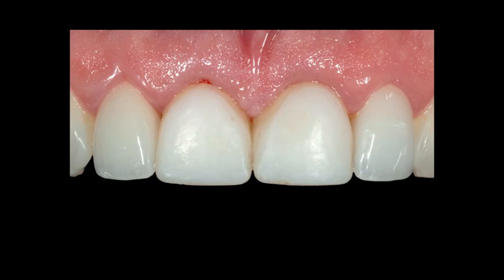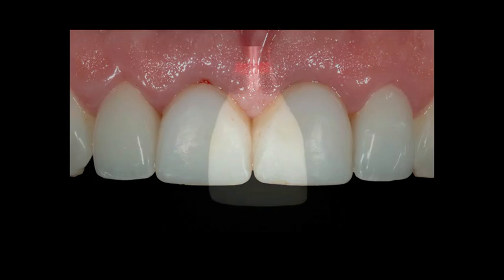So what I want now is I'd like my final impression to represent this really closely. And if you take these provisional crowns off, basically this tissue will collapse a little bit because it's not being supported anymore. So what I would like is I'd like to take my implant impression transfer and have it support the tissue the same way that these provisional crowns support the tissue. So I'll show you the technique for that.